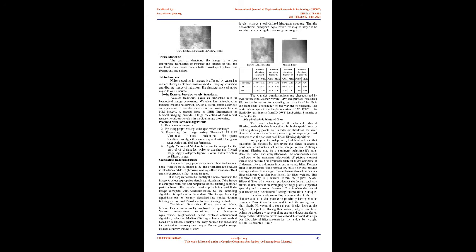The denoising technique should not affect or destroy information content in the image. The removal of background noise while preserving edge information of suspicious areas in mammograms is the intended objective. Various enhancement techniques, viz. histogram equalization, neighborhood-based contrast enhancement algorithm, selective median filtering enhancement method based on multi-scale analysis, have been used for enhancement of contrast of mammogram images.